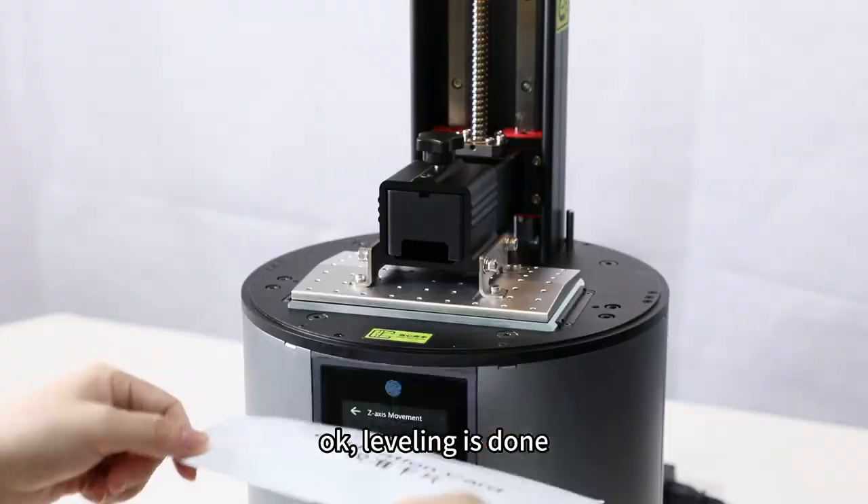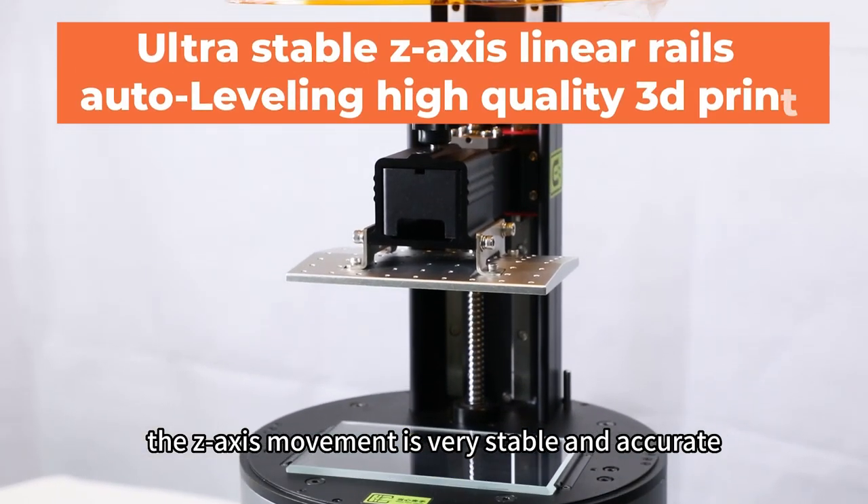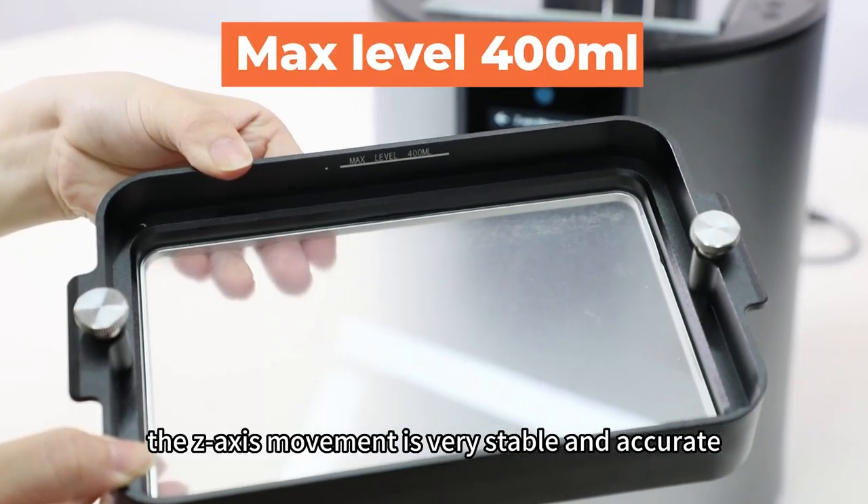Okay, leveling is done. With two linear guides and bolts screws, the Z-axis movement is so stable and accurate.